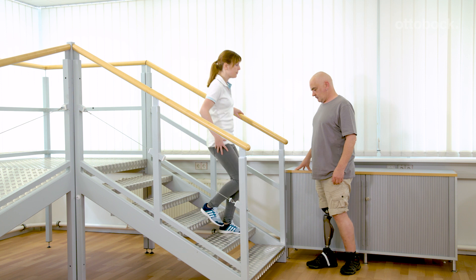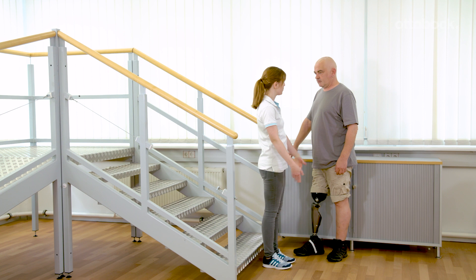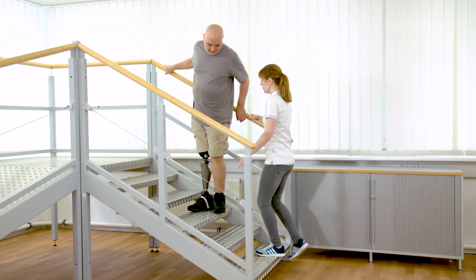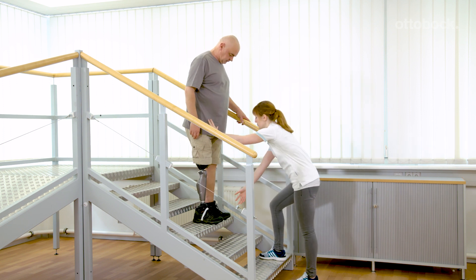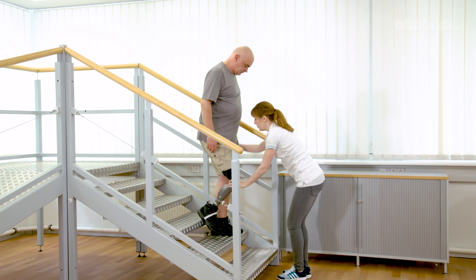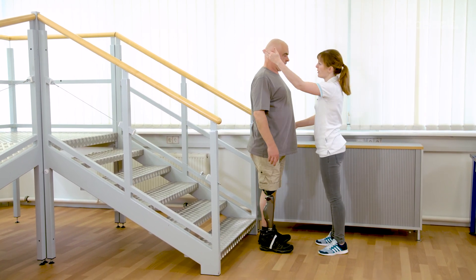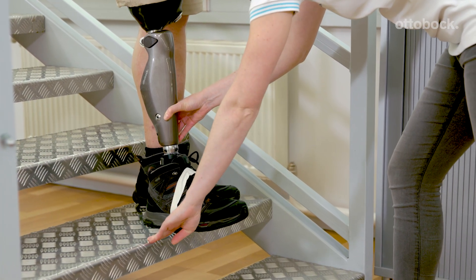The upper body should always stay upright. Focus on the correct foot placement and the weight shift to the prosthetic side. Initially, do the exercises step by step. If necessary, Franziska supports the timing of the knee flexion by slightly moving the knee into flexion. The white mark helps Gerhard to place the foot correctly.